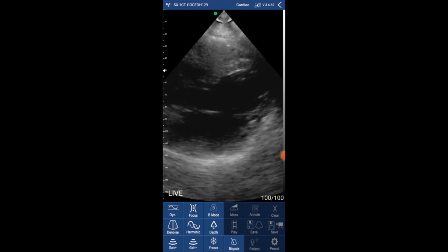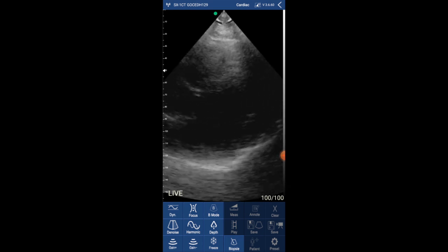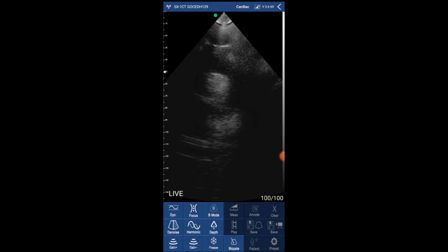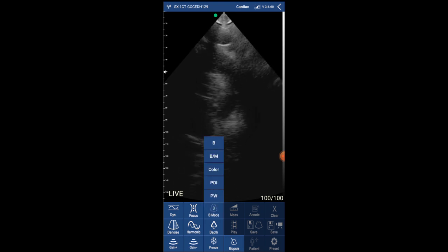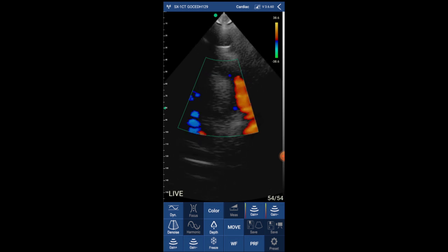To finalize, I'm going to show you another suprasternal view from a different person. This time the image is more clear, and I'm also trying the color Doppler on the descending aorta. What do you think about the color Doppler? Let me know in the comments.